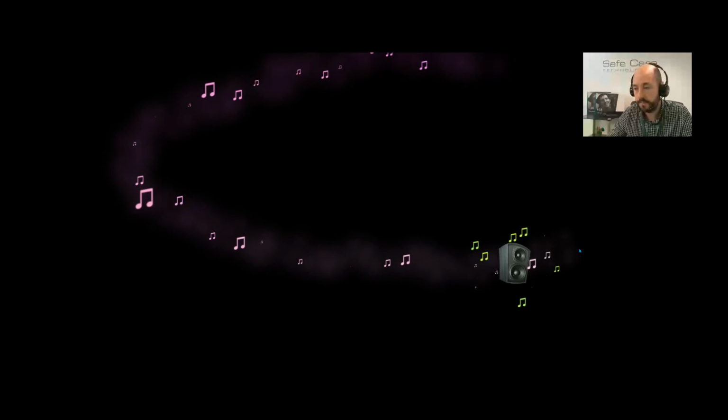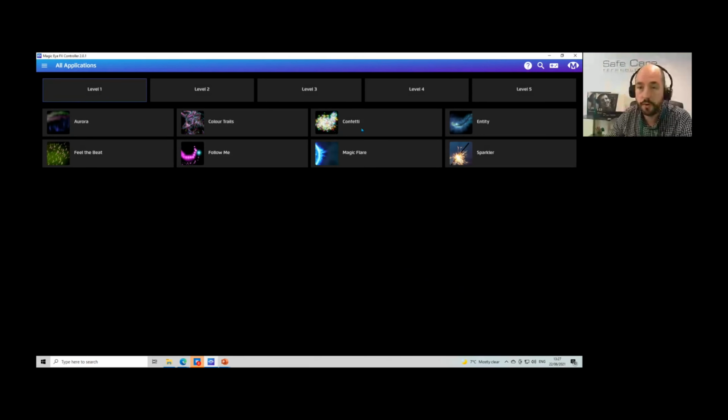And then I can say appear. And we have the speaker. And again, the same. I can just move across the screen until I hit the speaker. And then that disappears for me. Okay. So that is your simple level 1, but I'll just show you a few other different levels as well.